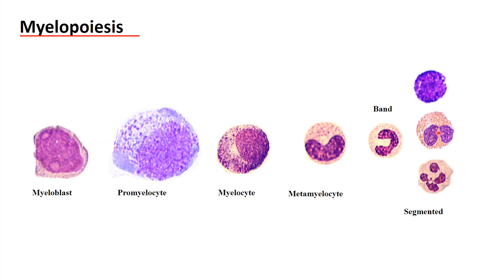Make a note: the eosinophil granules are not red. Usually they are brown — darker, not as fine as a neutrophil. Much bigger and darker granules can be found in the basophilic granulocyte.